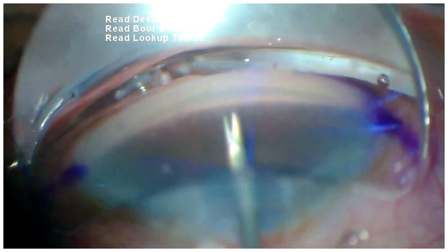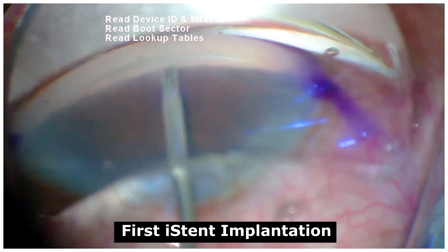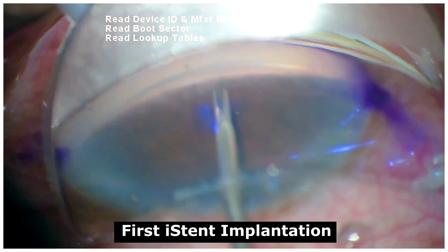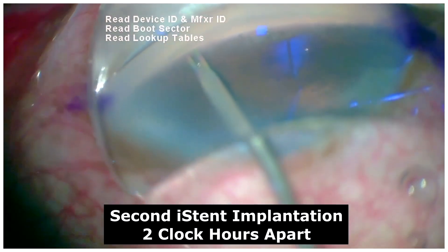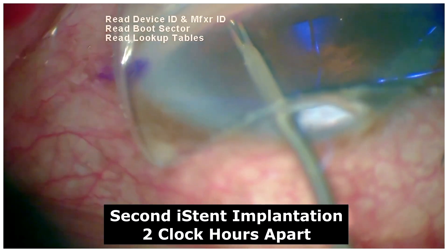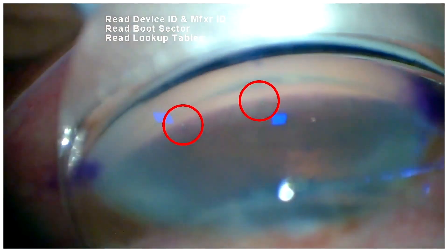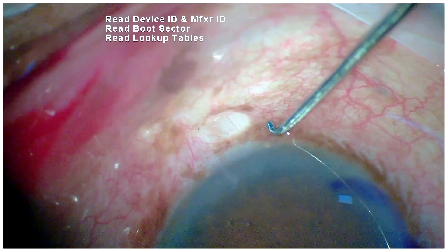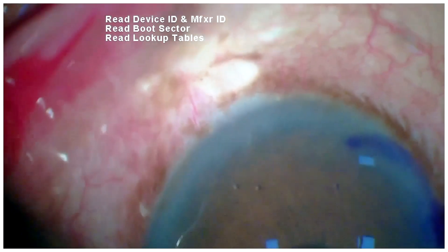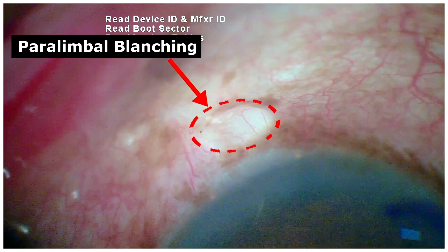For proper placement of the G2 iStent, we need a proper dimple at the angle depicting good firmness, to ensure that the iStent is well placed within the trabecular meshwork. Additionally, a second iStent is placed in a similar manner, at least one to two clock hours apart. Here we can see the two iStents adjacent to each other via the limbus, and an area of paralimbal blanching, which depicts successful outflow.